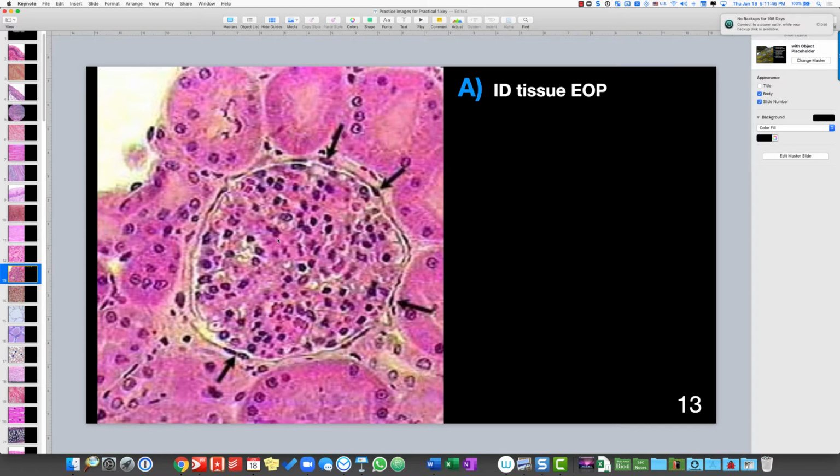Okay, and then there's actually a simple squamous epithelium here making up the glomerulus as well. So this structure together is known as the renal corpuscle. And I showed the image of a nephron in class, so you can Google nephron to look up the structure again for review.